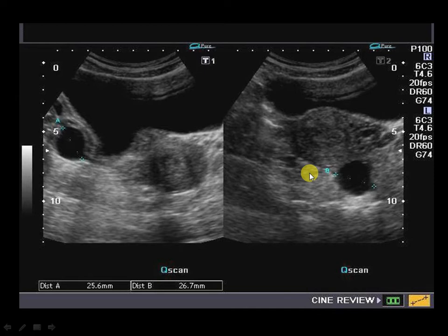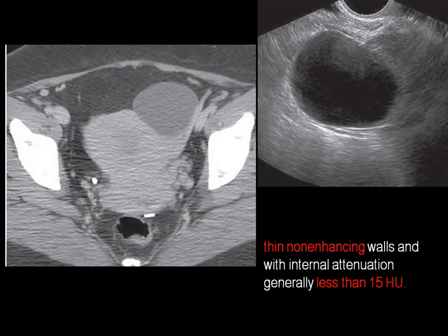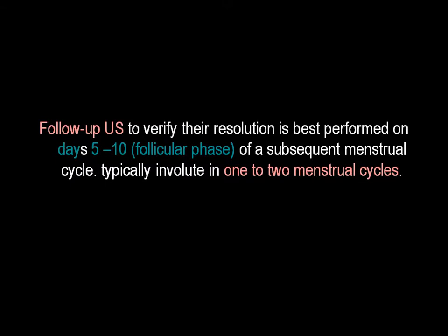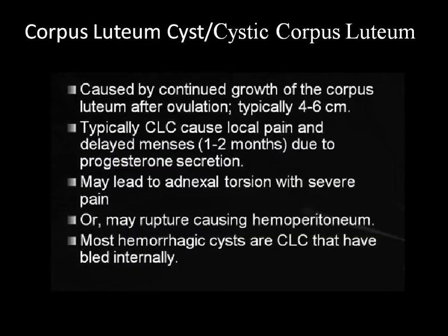On CT, functional cysts appear as thin-walled, non-enhancing cysts with clear contents and clear surrounding fat planes — the same appearance seen on transvaginal ultrasound. If you see internal debris, it might be due to hemorrhage or infection and may be the cause of pain. You need to do a follow-up ultrasound to verify resolution, performed within 5 to 10 days of the subsequent menstrual cycle. Usually they resolve within 1 to 2 menstrual cycles.